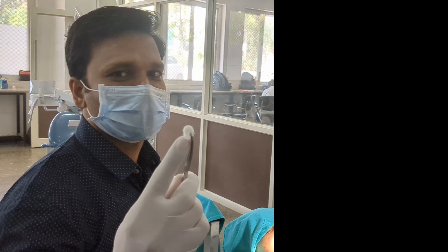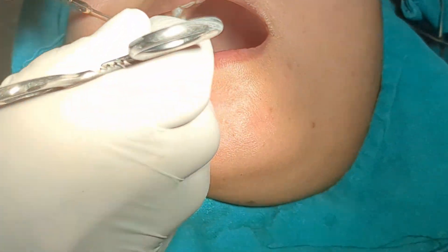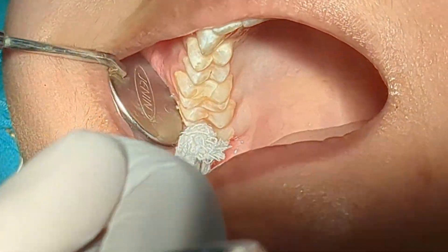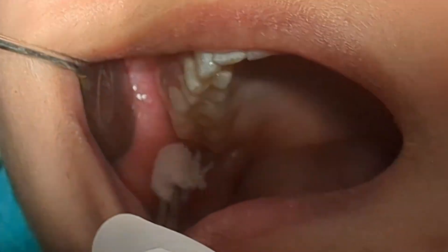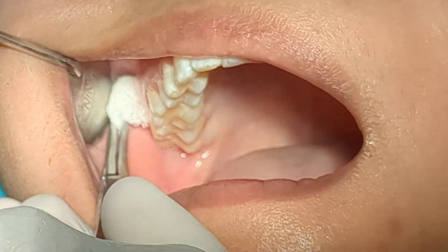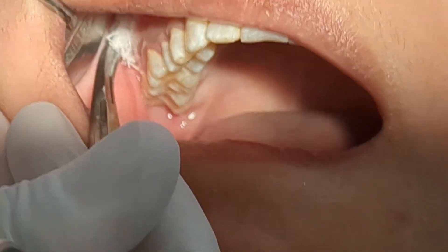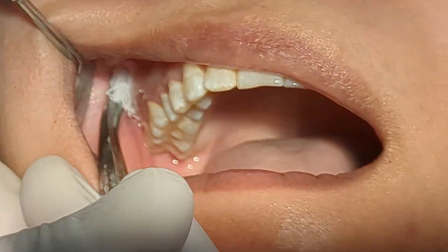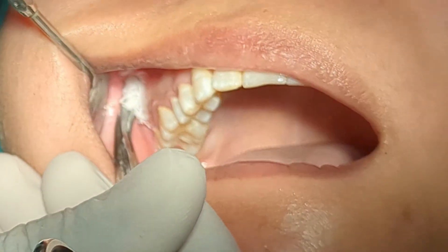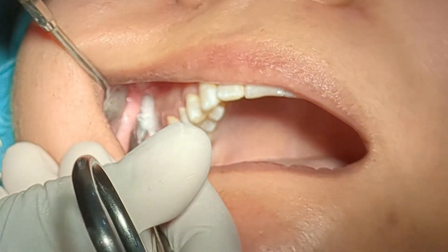This is a gauze soaked with a topical anesthetic. I am going to apply topical anesthetic at the site of injection. The site of injection for PSA nerve block is depth of mucobuccal fold at the apex of maxillary second molar. I am applying pressure over the injection site. The reason I apply pressure along with topical anesthetic is to induce pressure anesthesia. Topical anesthetic along with pressure anesthesia induces a profound topical anesthesia, so the patient doesn't feel the needle prick at all.